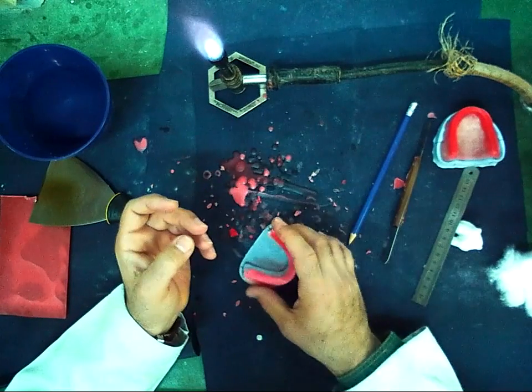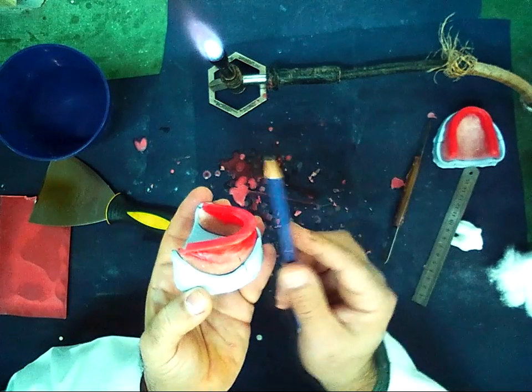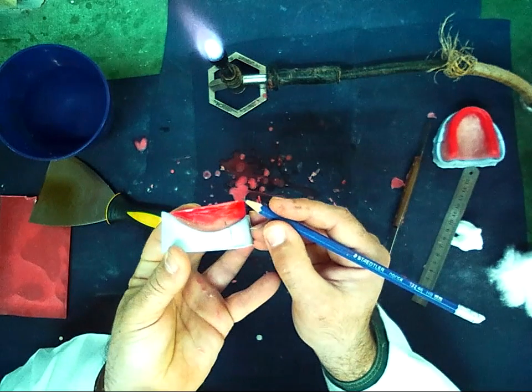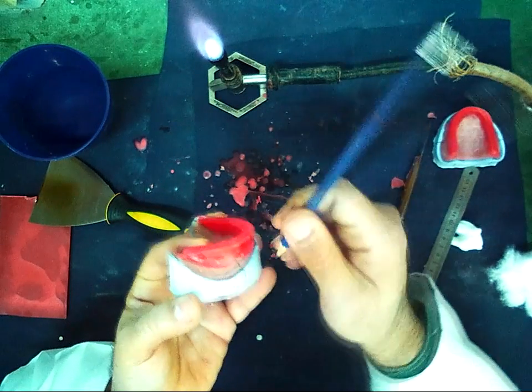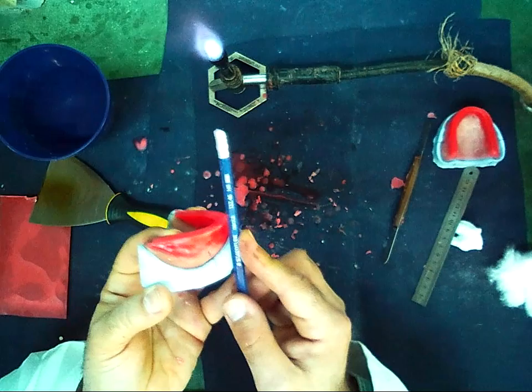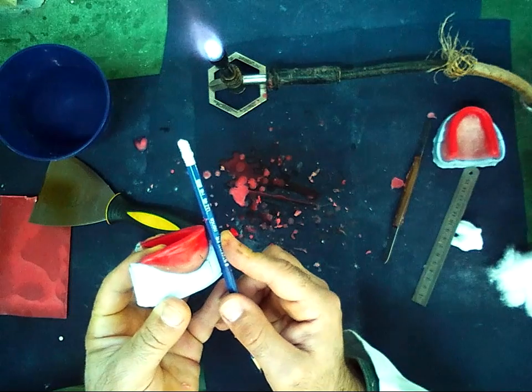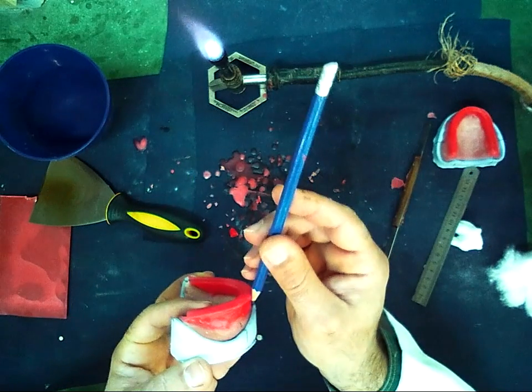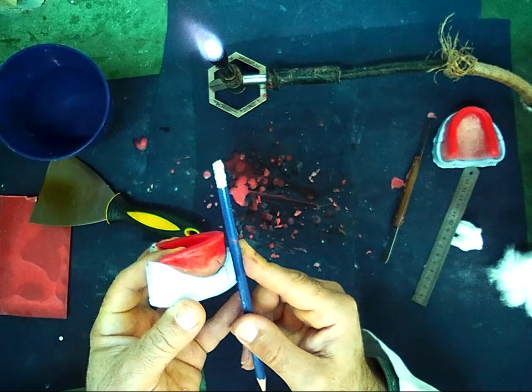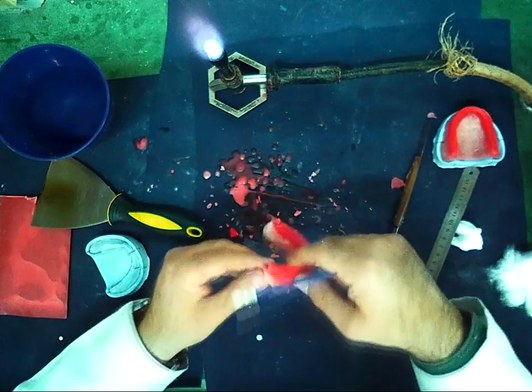The anterior part of the bite rim should be in a straight line. And I can see it is not a straight line. There is an excess of the material in this part. So I should make it in a straight line. Should be parallel with the pencil when I put it in this side. It should be parallel, not touch it. The labial surface should be parallel to the pencil. Now I can see it is not parallel. There is an excess of the wax in this area. So I should remove this part.